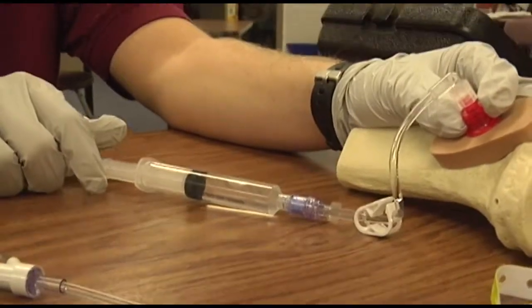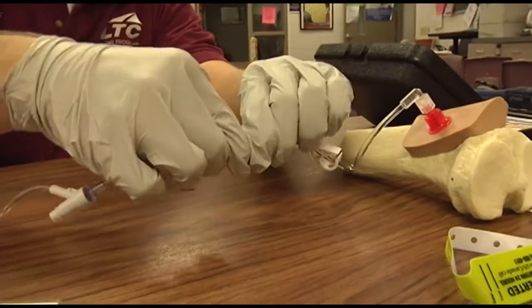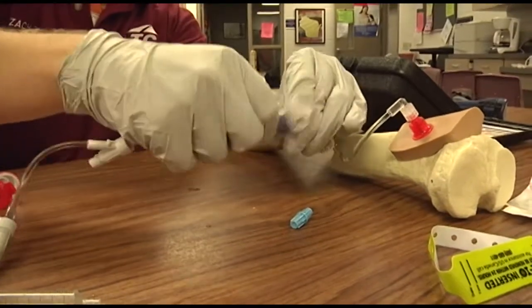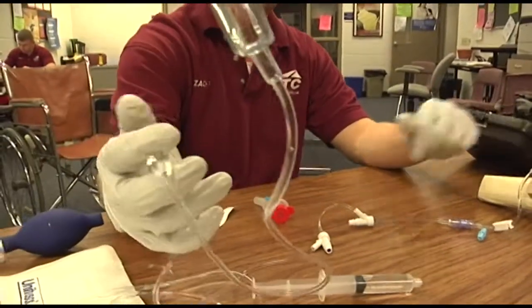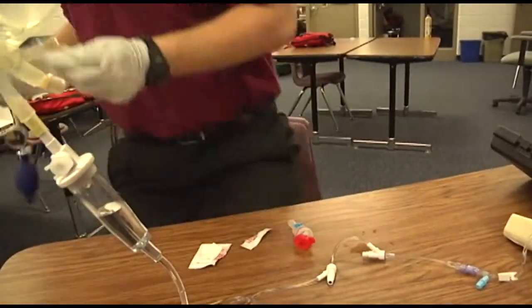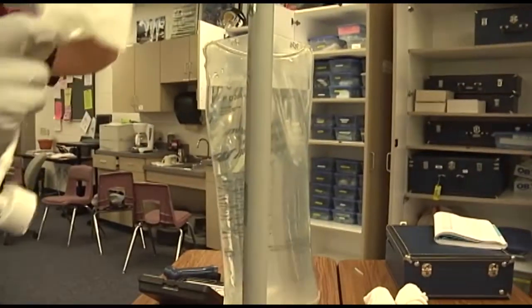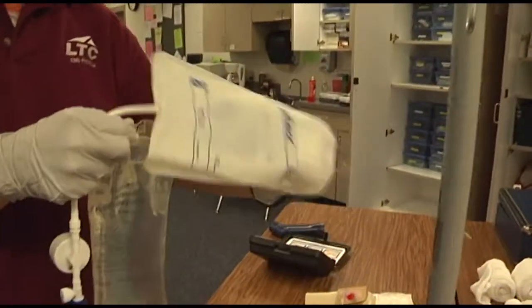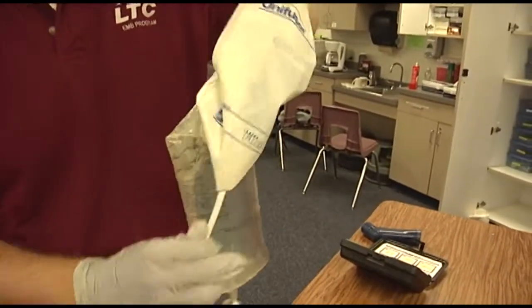You would now connect the administration set to the extension set — it'll just screw right on there. Begins infusion with pressure. Pressure may be needed to infuse the fluid. Set up like that because you realize all your tubing is already hooked up.